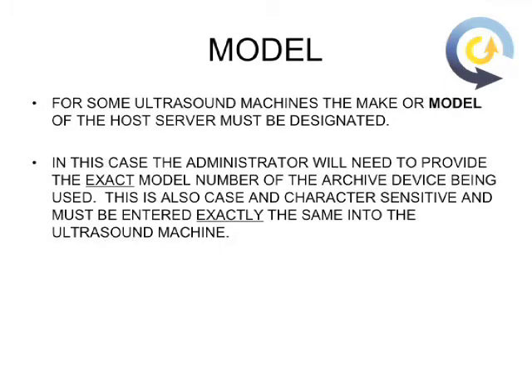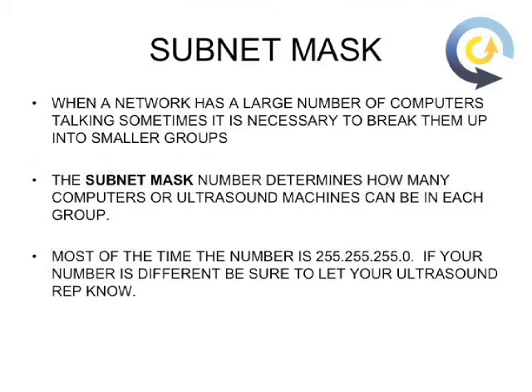Model. For some ultrasound machines, the make or model of the host server must be designated. In this case, the administrator will need to provide the exact model number. This is case sensitive and character sensitive. So it is extremely important that if you're using a model number, it must be accurate to the system that you're using.